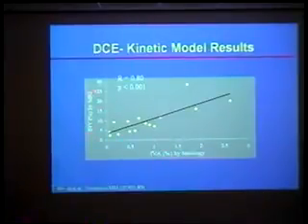This is what we can get with so-called kinetic modeling, using MR dynamic data, as a fractional blood volume seen within the plaque. And we showed, based on this many cases, I think this is 20-something cases, there's a pretty strong correlation between the two.